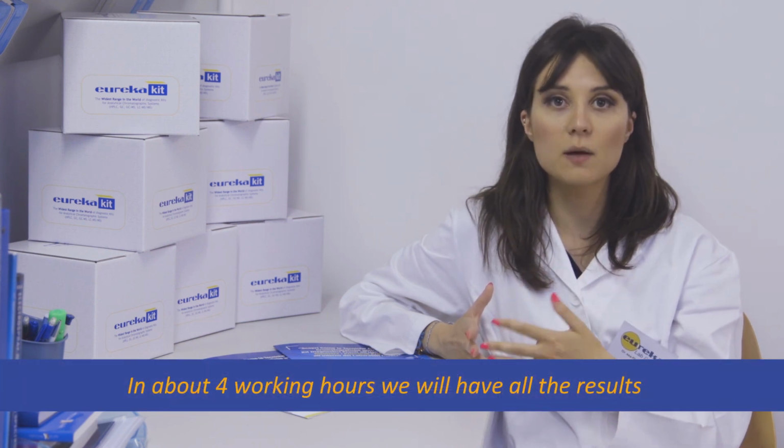Every 18-19 minutes, we will get a result. So, for our session of 5 keratin samples, plus 6 calibrators and 2 controls, in about 4 working hours, we will have all the results.